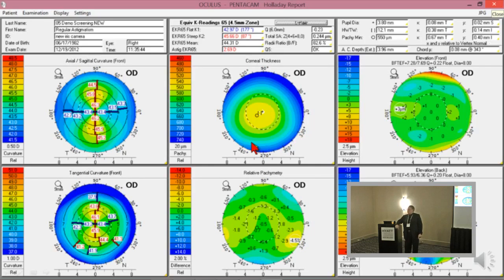Well, what that means is the astigmatism in the 3 millimeter zone is not at the same axis as it is in the 5 millimeter zone, and that's not the same as the 7 millimeter zone. When you see that broken bar, and the same thing in the horizontal, you know that for a toric lens, there's not one axis that you can identify that's absolutely perfect.